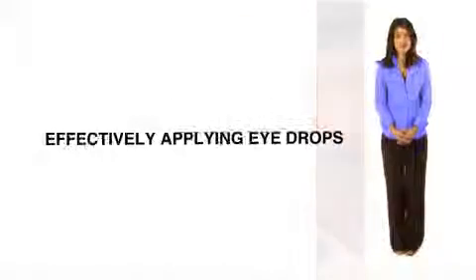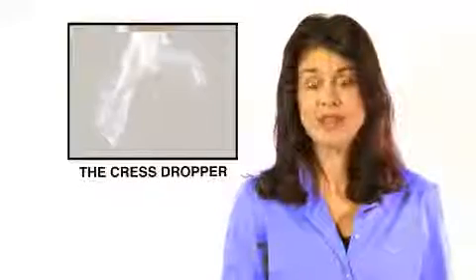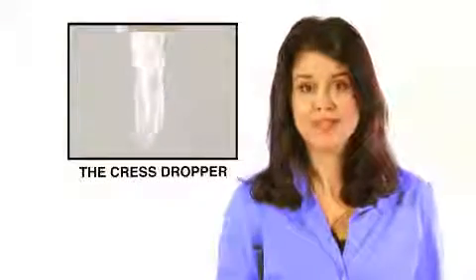No matter your age, gender, or ailments, the Cress Dropper provides a safe and significantly more effective way to apply eyedrops. Now that you've been introduced to this new innovation, please ask your doctor for more information. Thank you.